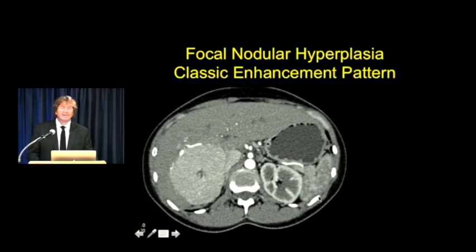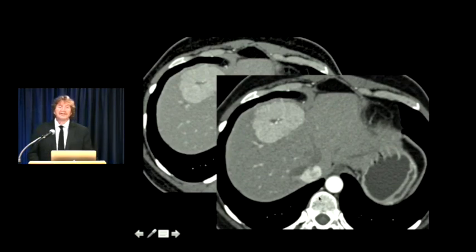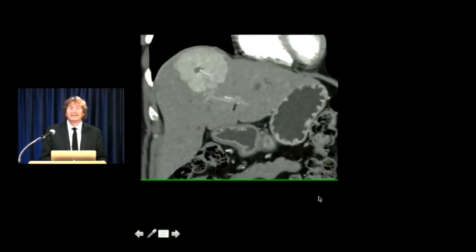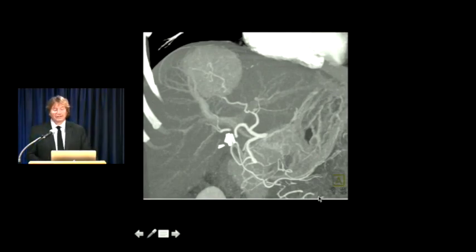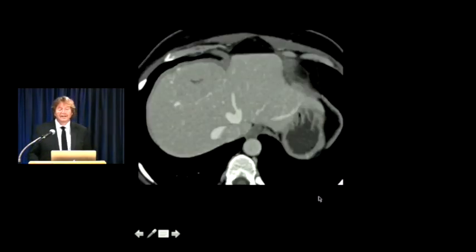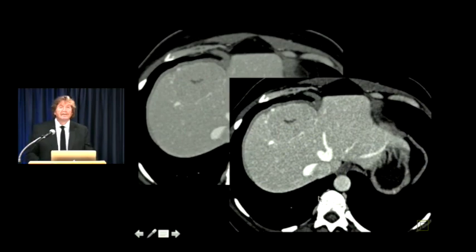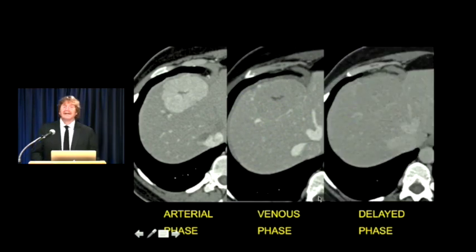FNH is most commonly solitary but can be multiple. Here's a nice example of two lesions looking identical, with the feeding vessel going into the center of each. Another case: central scar, homogeneous, attenuation identical to the IVC. You can see a second small lesion - the classic FNH. Carrying to another patient, the same lesion: central scar, homogeneous, hypervascular but only looking like the IVC. The feeding vessel goes right to the center, and on MIP the vessel is even better shown. As you go to venous phase, the lesion is harder to see - at delayed imaging you would have missed a 7 or 8-centimeter mass. So FNH is a very important lesion to recognize.